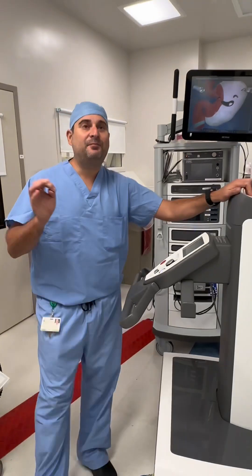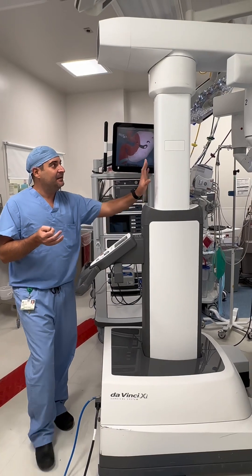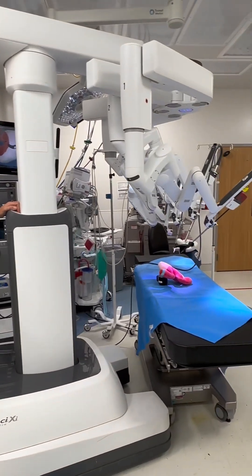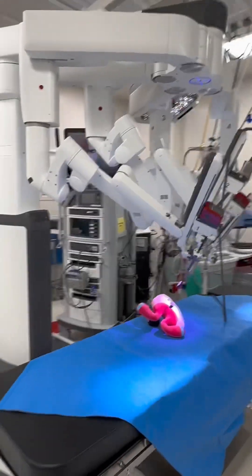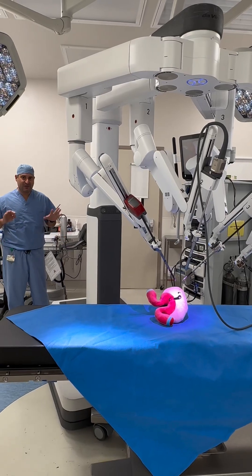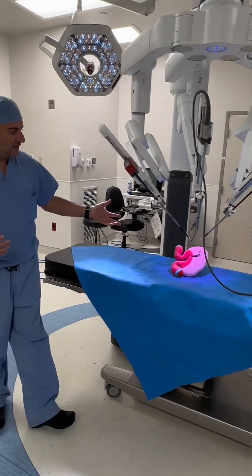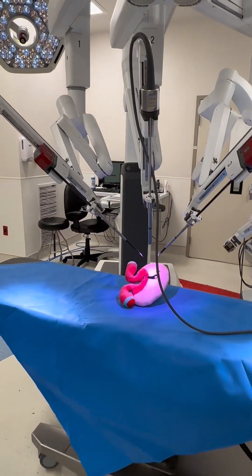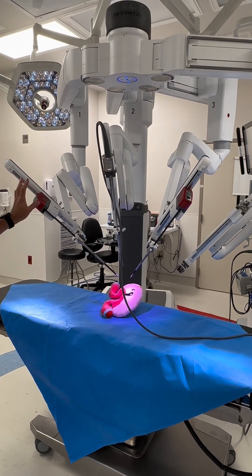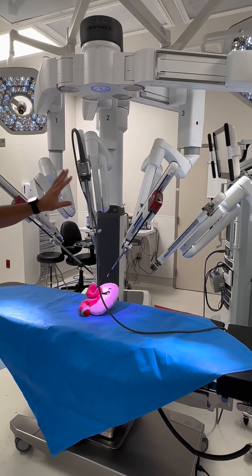This is the main part of the robot that most people think about — this is the patient cart. It actually has four arms: one of those arms is a camera, and there are three other arms. This robotic patient cart is wheeled in on top of the patient — today we have Barry, a stuffed animal, as an example. This is the part of the robot that does the interaction with the patient, so instead of having just two hands like a regular surgeon, this has four arms.